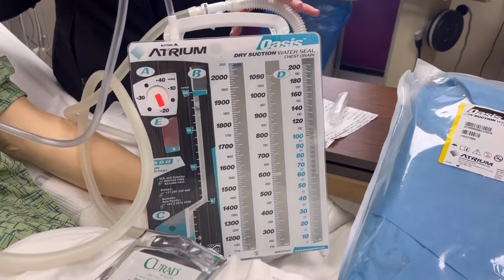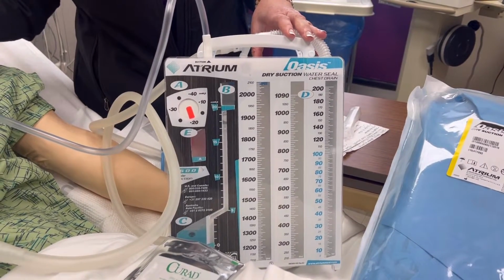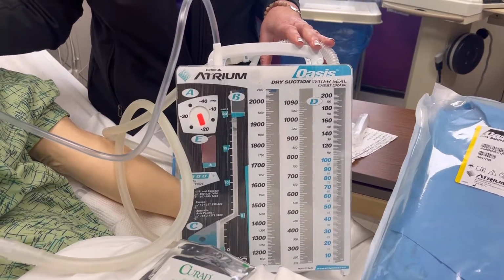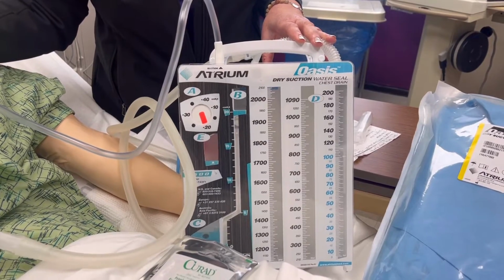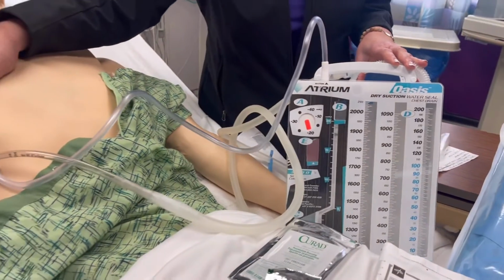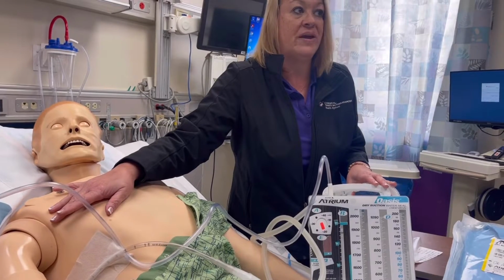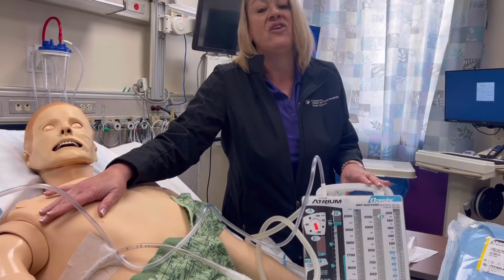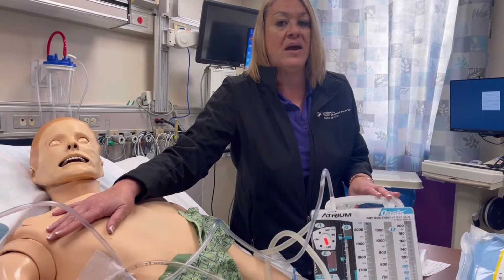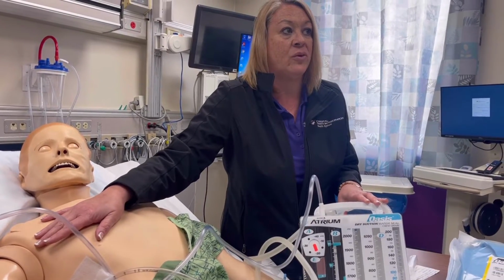The first dressing is typically placed by our provider, although they may ask your assistance with it. Dressings are changed typically daily. They can also be changed PRN for soiling, or as often as the provider indicates. Very commonly, that first dressing is not changed immediately, or it may even be changed by your surgeon the very first time. You'll just need to check your orders, and your orders for your suction and for the dressing will be either in the provider orders, in the chest tube management, or it may be in nursing communication orders.